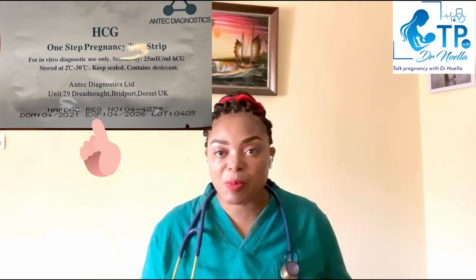So once you buy your test strip, maybe if you want to do the urine test, which is 99% accurate, you need to make sure you read the leaflet. Why? Because there's a given time. If you read the results too early or too late, it affects the result, so you need to read at the time which is given. Then you check the expiry date, because it's very important. Once it's expired, it can give you a faulty result.